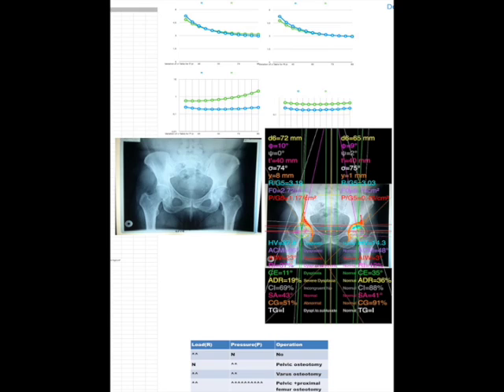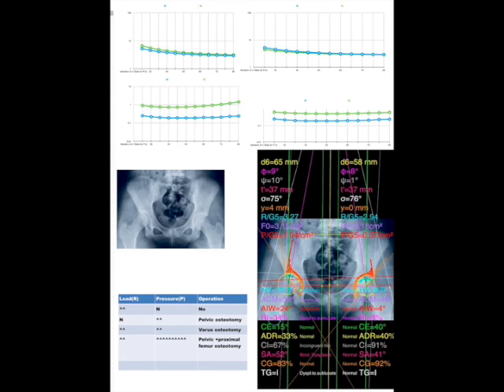The software is a Class II medical device in the FDA. All information received from the software output must be clinically reviewed regarding its plausibility before patient treatment. Hip Dysplasia Pro app is indicated for assisting healthcare professionals. Clinical judgment and experience are required to properly use the software.